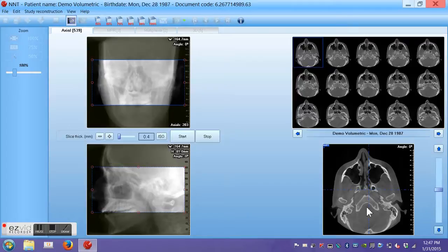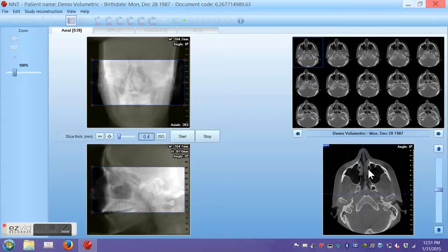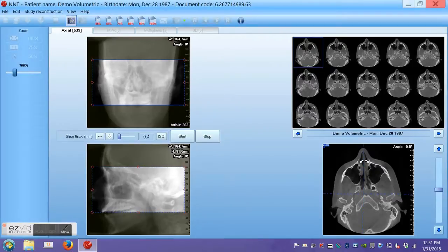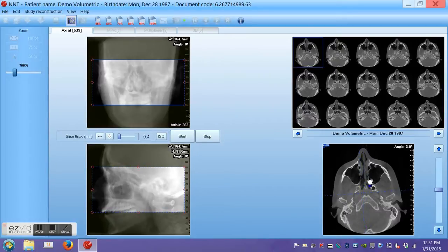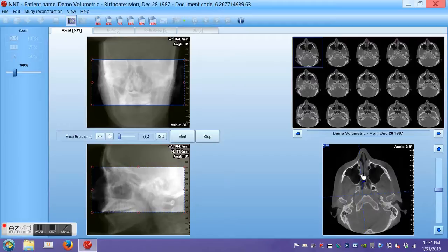You can see that there are two blue lines perpendicular to each other. Using your mouse, you can rotate the lines with the curvy arrows, or by moving your mouse to a different position, move the lines laterally or vertically. I am going to move the vertical line to the midline on the patient and make sure that its orientation is right through the middle.